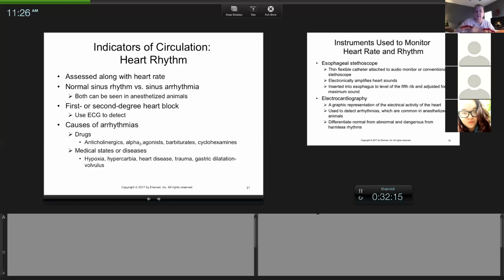I call it a regular irregularity. It's an irregular heartbeat, but it happens on a regular basis. So it's kind of a regular irregularity. And that one, I don't have to confirm. I mean, you'll see it on the ECG, you'll watch breathing.